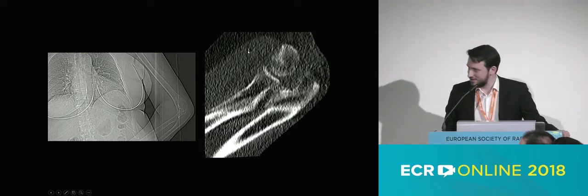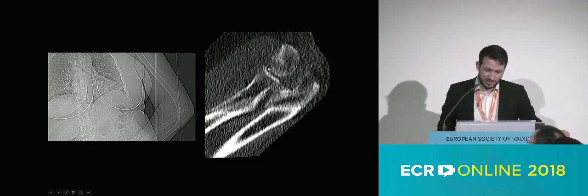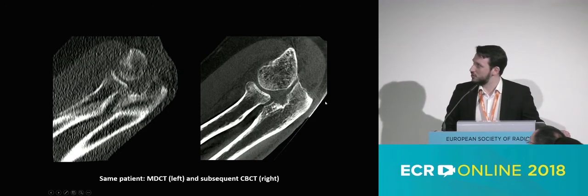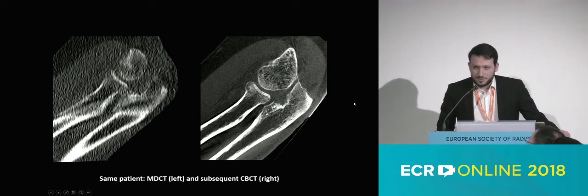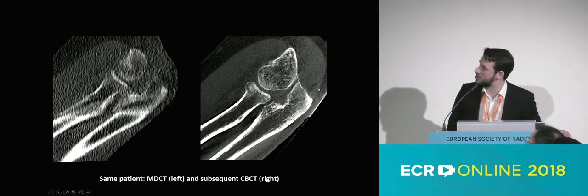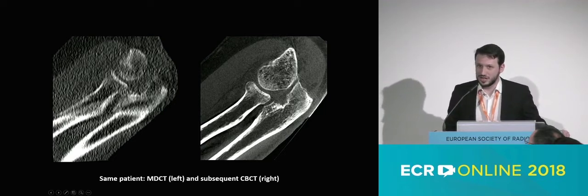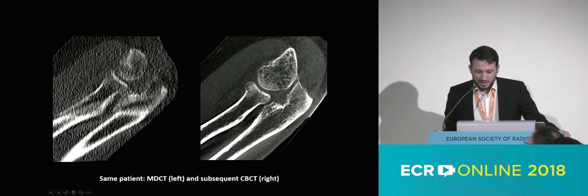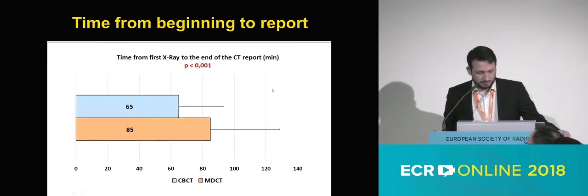They tried once, they tried twice, and you got this image. So I was just here that day and said, okay, let's try CBCT. And everybody told me, no, it's not a good idea, she's old, it's not going to be possible. We tried, however, and it took just 2 minutes to position the patient in the device and to do the acquisition. So there is actually no limit. You can really perform interesting things even in old patients, even painful patients, even elbow patients. You can do everything. And then we saw this tiny undisplaced radial head fracture.